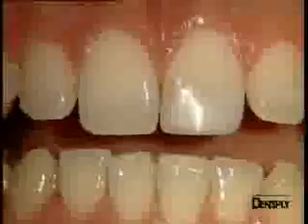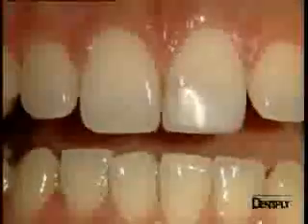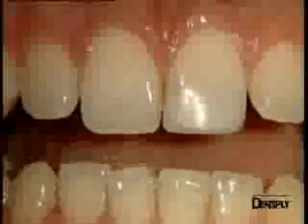The clinical case of this patient is an aesthetically deficient composite at tooth 21. The preoperative X-ray picture shows the very large volume of this restoration, which involves the whole of the incisal edge.